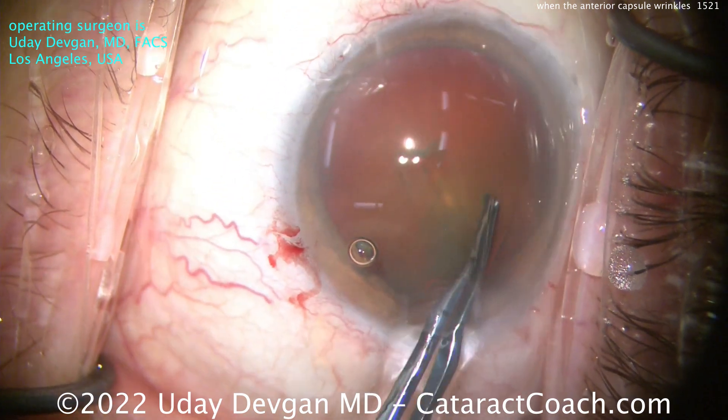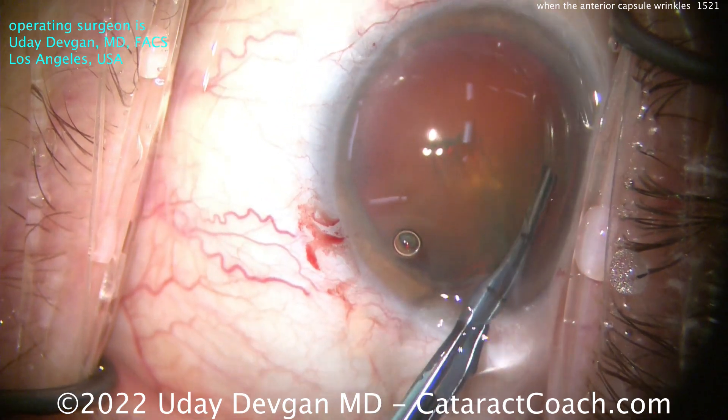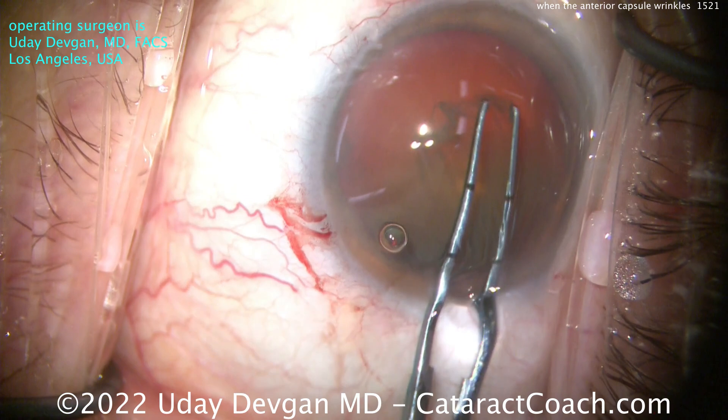Let's make a very careful 5 to 5.5 mm capsulorhexis. I'm watching the entire time, making sure the whole lens isn't shifting on me.